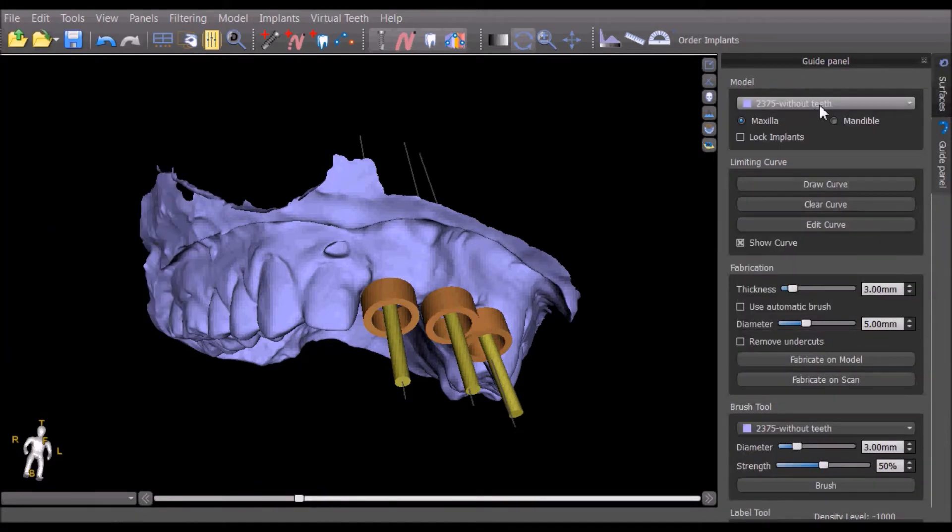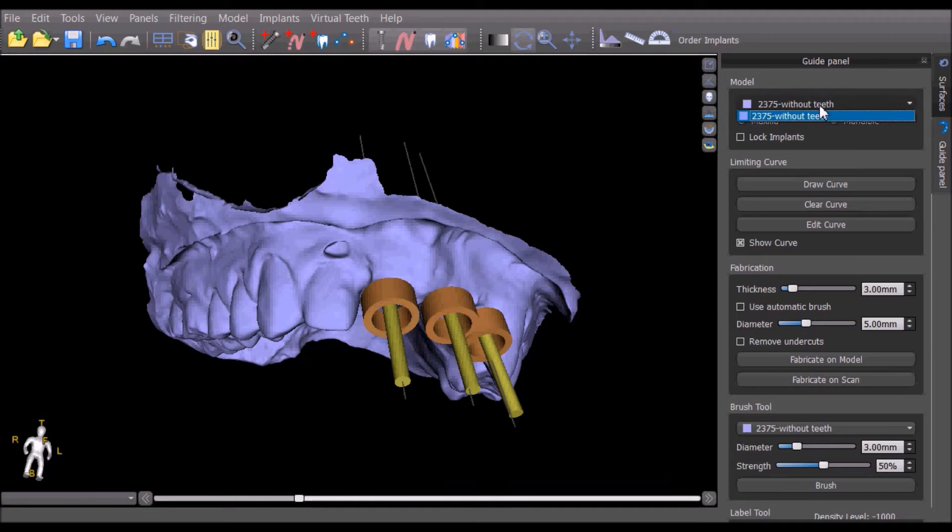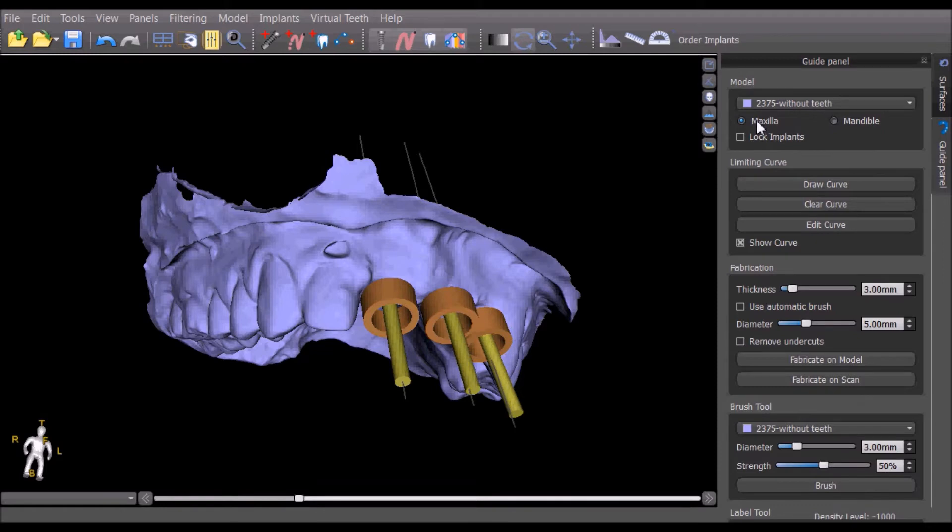We select the relevant model on which we would like to make the surgical guide from the drop-down list, the correct draw type, and then check the lock implants checkbox.